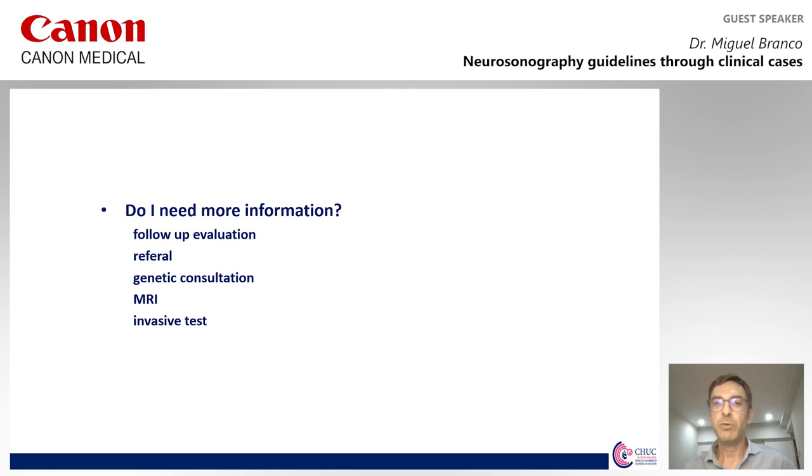At the end of our fetal neurosonography, we may need more information. We may have to schedule a re-evaluation. We may have to have a genetic consultation, an invasive testing, or an MRI. Fetal MRI is complementary to neurosonography, not a screening evaluation of the fetal brain.